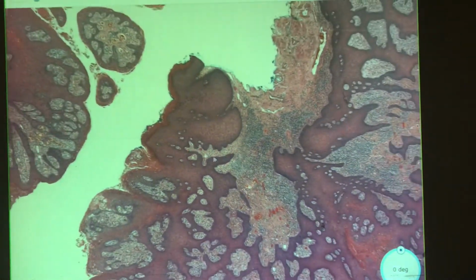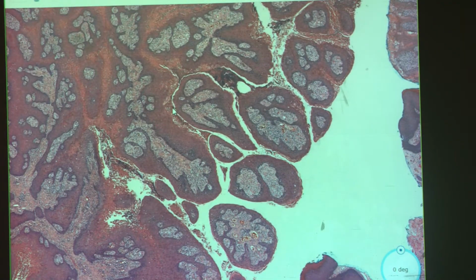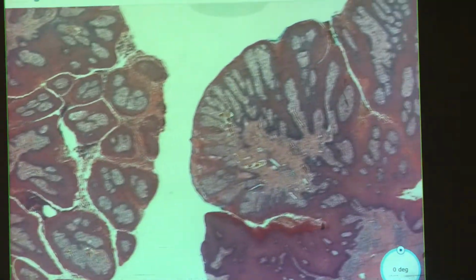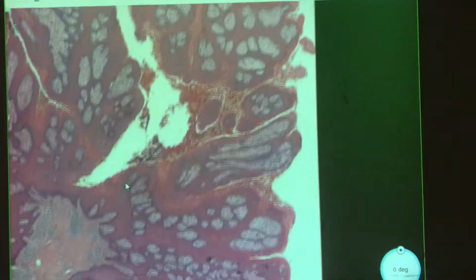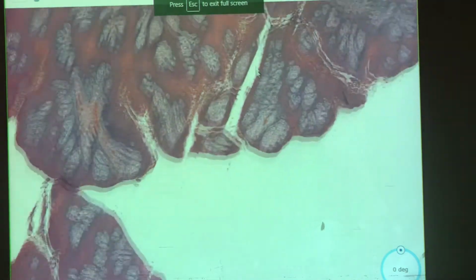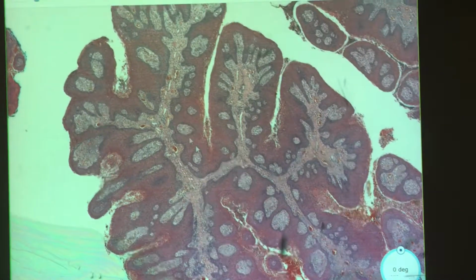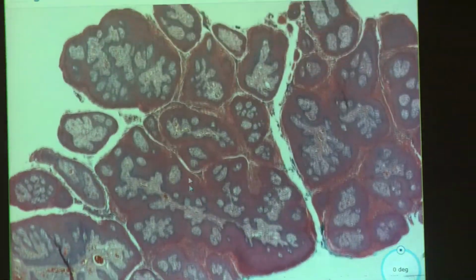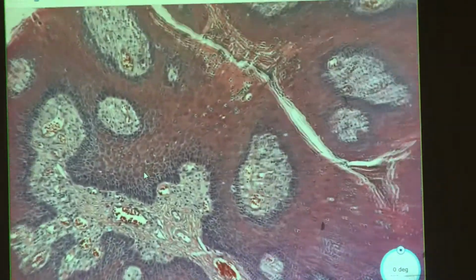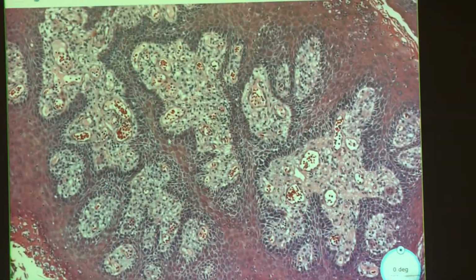So I think, is it acanthosis when you have sort of the thickening of the, yes, yeah, so acanthosis. Not that much like keratin forming, but it does have like the swoops. Yeah, just go up to the arrows. Yeah. There we go. Perfect. Alright, so it kind of looks like that. It's kind of cut in a strange way, obliquely a little, maybe. But let's go in for a closer look and see some of the cells in the dermis here.